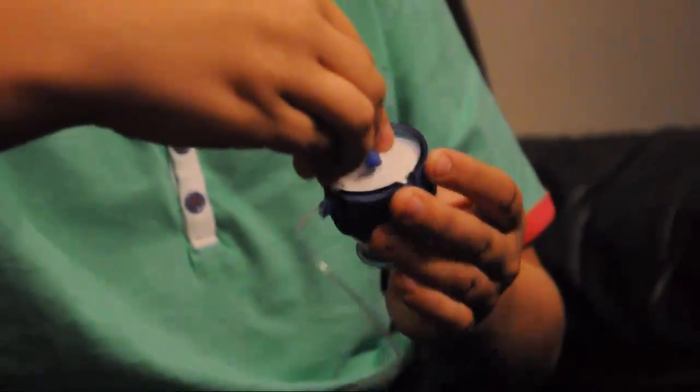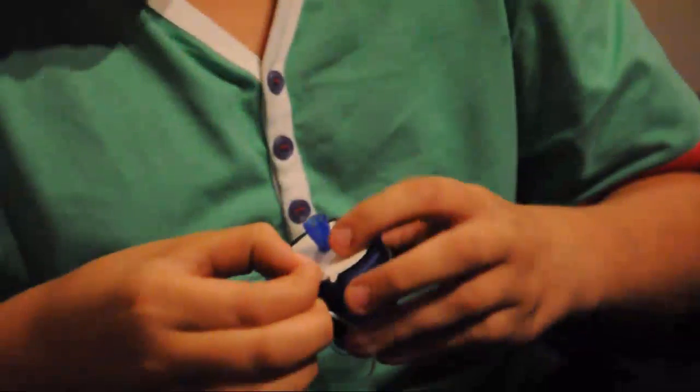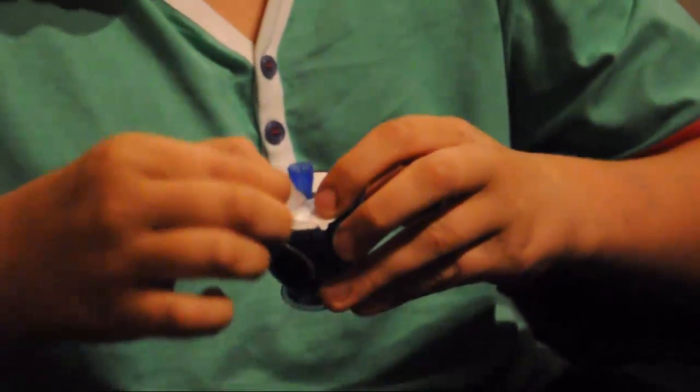You don't push it so it clicks, you just push it down far enough so that it stays in and doesn't fall out, so just make sure you check it. And then there's 2 little tabs on the side. Put your finger on one of them and pull one off.